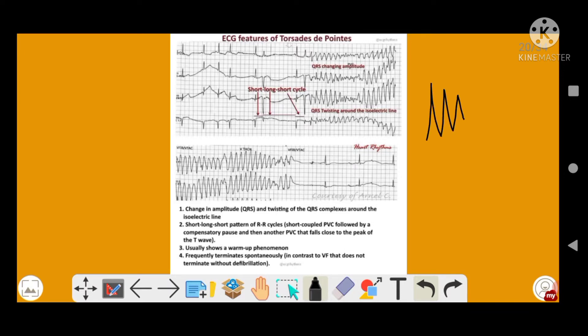It will come somewhat like this. So the QRS amplitude will be changing, right? Here it is more, then there will be low, then again there will be more. So the QRS amplitude is changing.